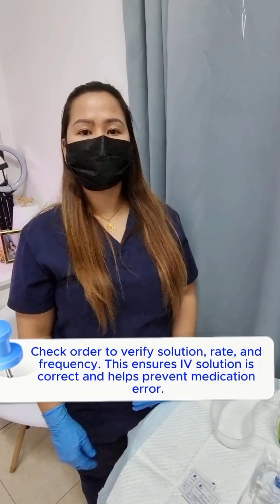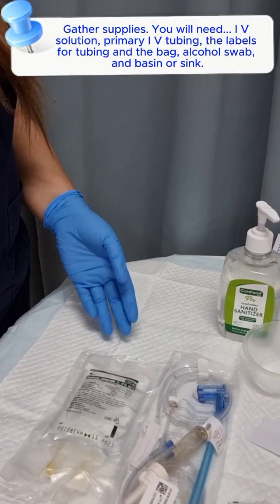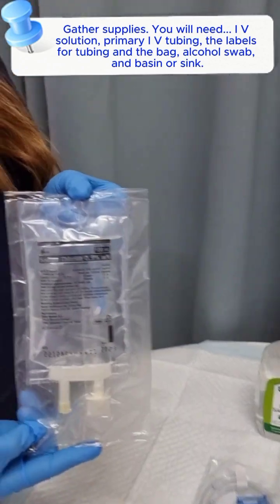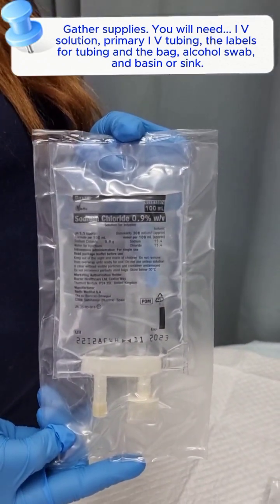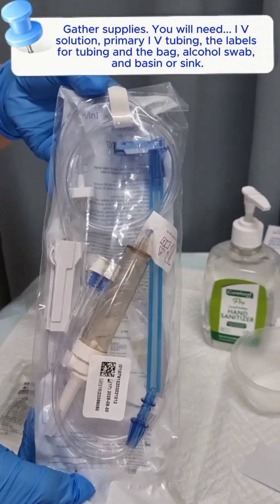Check the order to verify solution, rate, and frequency. This ensures the IV solution is correct and helps prevent medication error. Gather supplies: you will need IV solution, primary IV tubing, labels for the tubing and the bag, alcohol swab, and a basin or sink.